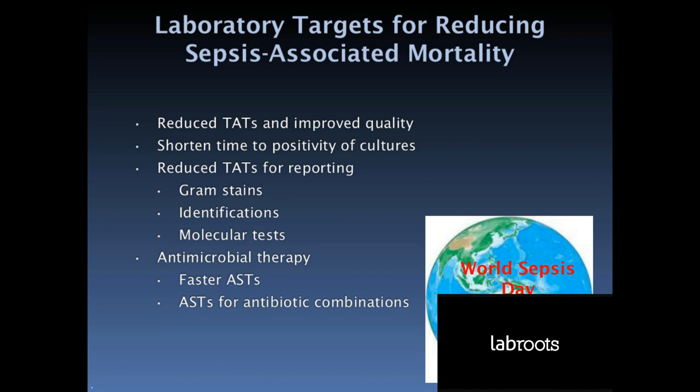And what that meant was that a positive blood culture could be put up immediately, and then photos of the zones were taken at exactly 4 hours, 6 hours, and 8 hours, so that you didn't miss the reading times, and the photos were there for experienced microbiologists to check, to be used for teaching purposes. That was very handy. I think we got something like 74% of interpretations within 6 hours, 100% of interpretations within 8 hours.